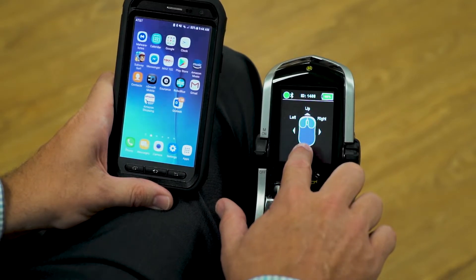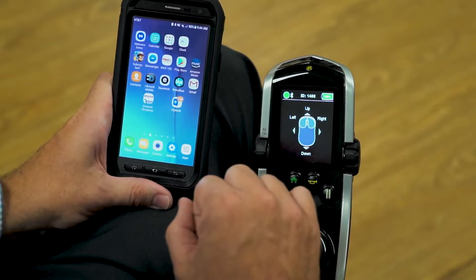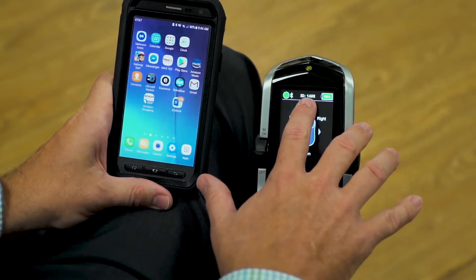The mouse on the screen is grayed out, and the top bar is still black. Those will turn blue when we're paired. The ID number we're going to be looking for for our Bluetooth chip is 1408.